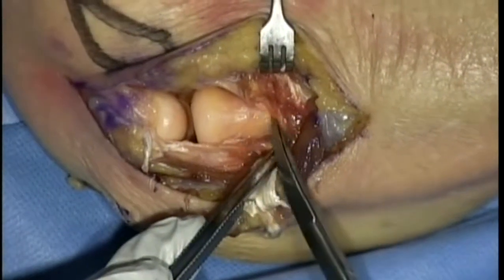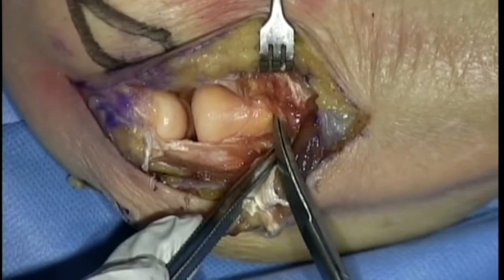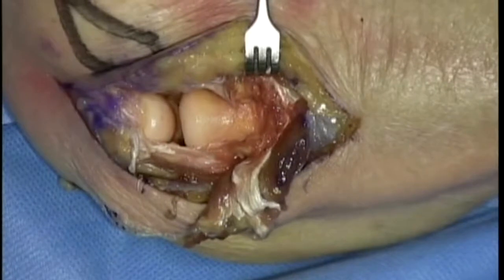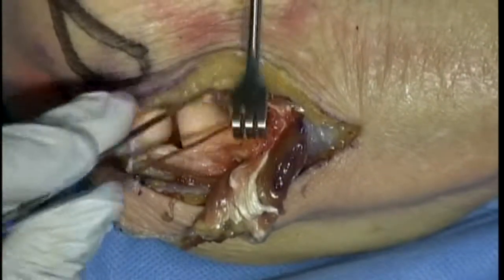If I had to do anything more distal than what I'm looking at here, I probably would get at it from the volar exposure. Or do a formal dissection distally. And we're going to find the nerve there distally and work back up. Which they're going to see. Which we're going to see in a minute.